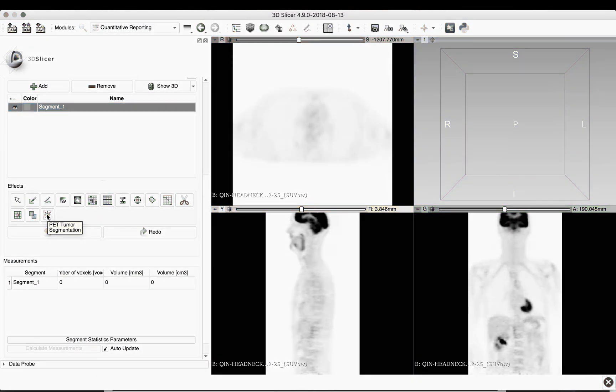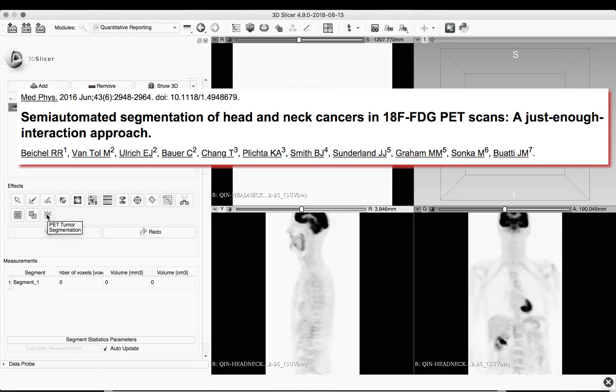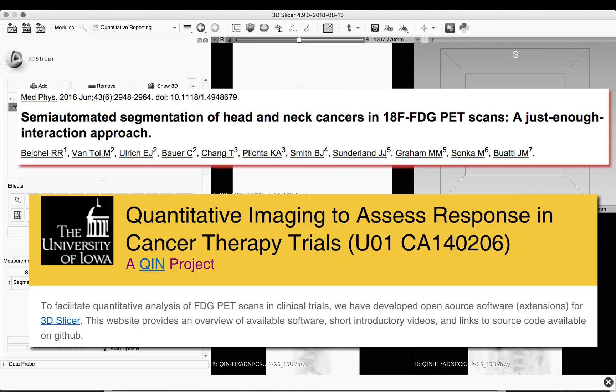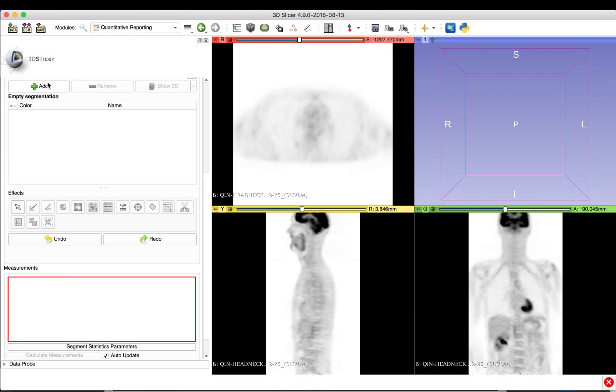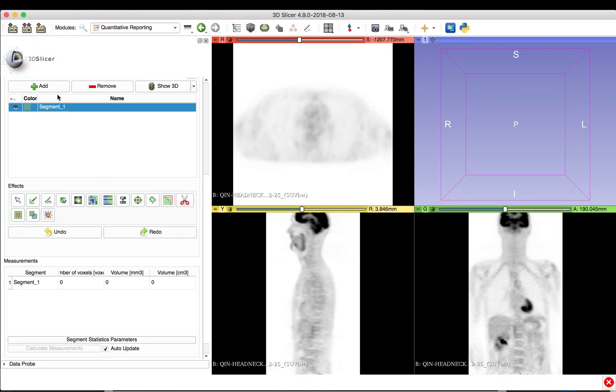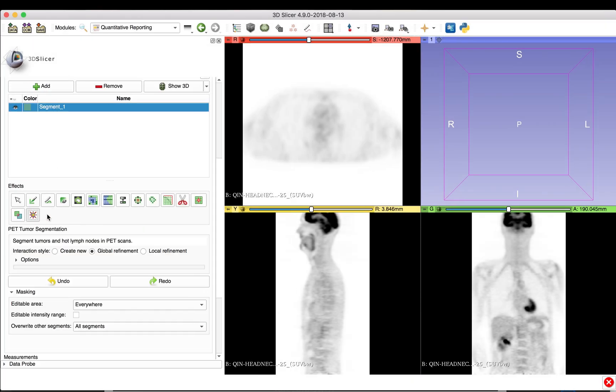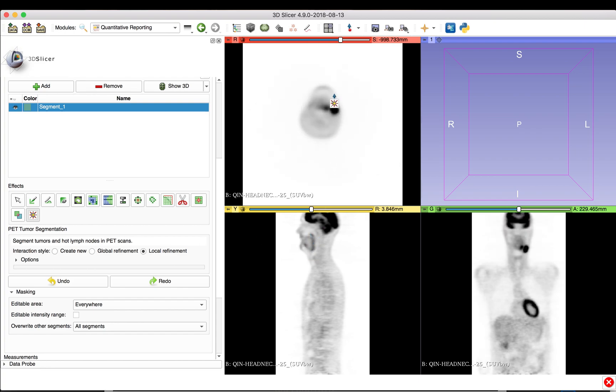More information about the segmentation method can be found in our paper or on the Tools website. To start segmenting a new lesion, click Add and select the PET tumor segmentation effect. Then, click roughly at the center of the lesion to start the segmentation process.